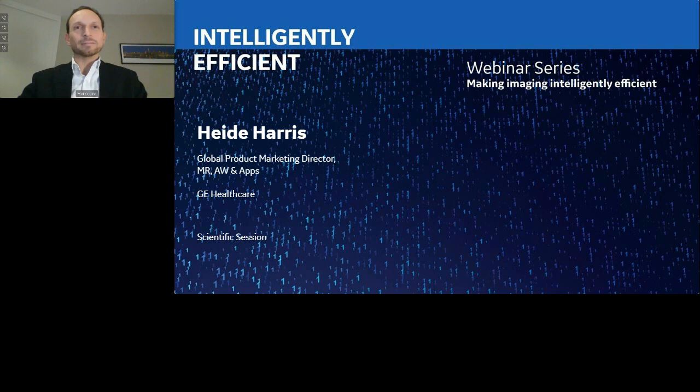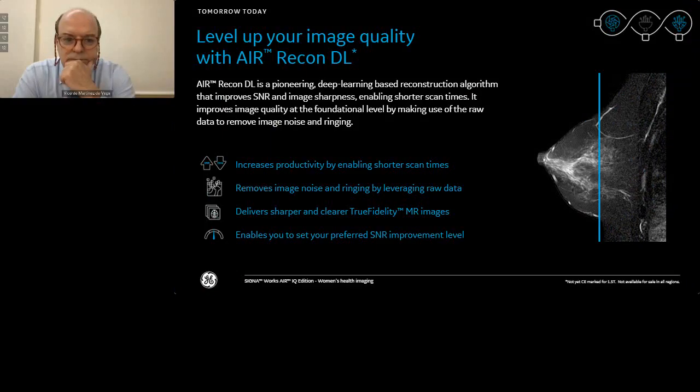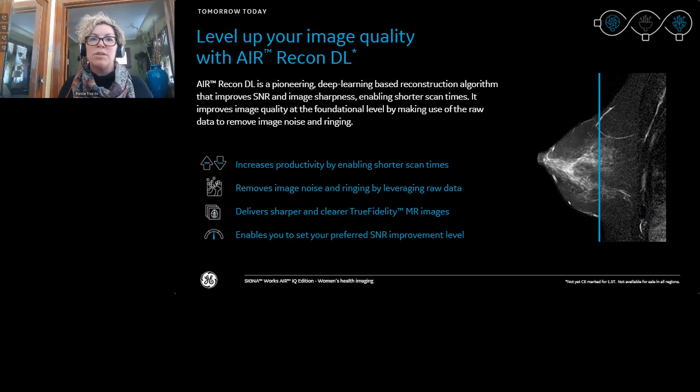Great, thanks, Mario. And I want to share a little bit about what you can expect with AI and deep learning solutions when it comes to MR. So with MR, there's always trade-offs, trying to balance signal resolution and the time spent to get it.